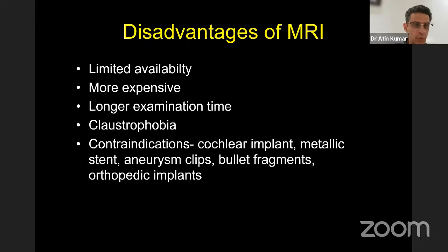In fact, we can do a complete CT scan of the head in 3-4 seconds for a child. Whereas for an MR, you would require at least 10 to 15 minutes, maybe sometimes 20 minutes. Even if we want to go fast, we'll require at least 10 to 15 minutes of MR.